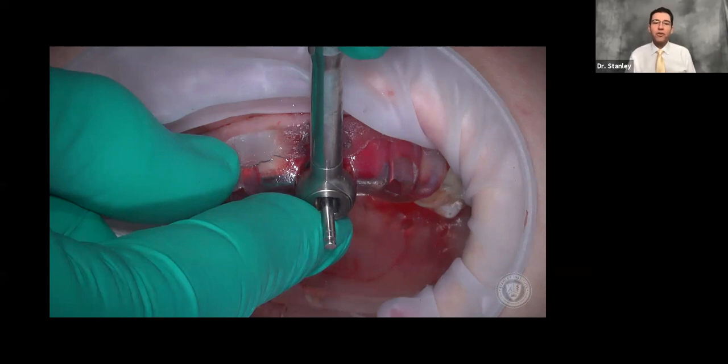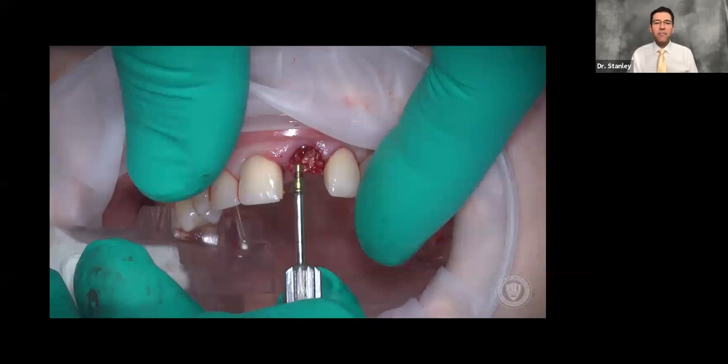We're going to carry it to the mouth. What comes in the BioHorizons implant is a complementary healing cap — it's not a healing abutment, it has no height. We're going to use this as a temporary blocking device to keep bone particles from going inside the implant. We carry it to the mouth and very, very carefully rotate it — because remember, we have about five threads engaging bone, which is not a lot. If we put off-axis loads on this healing cap, we could inadvertently loosen the implant and have a failure.